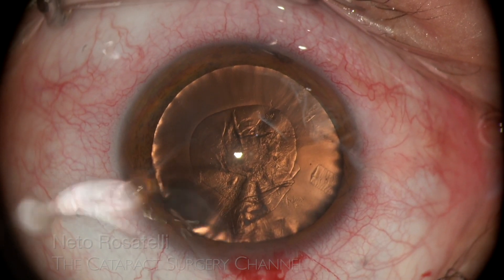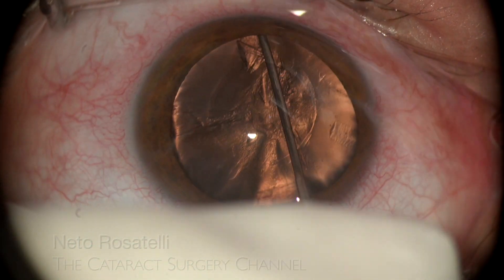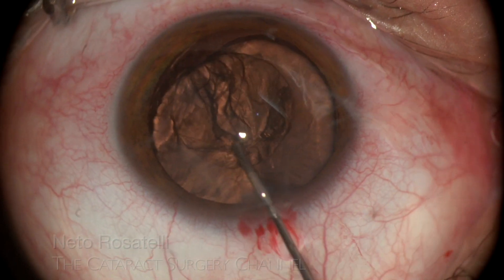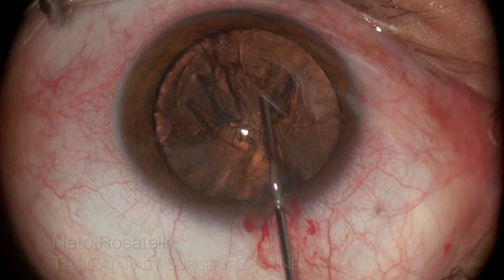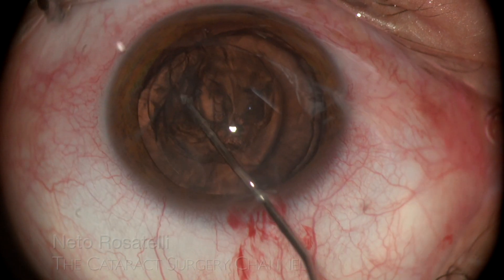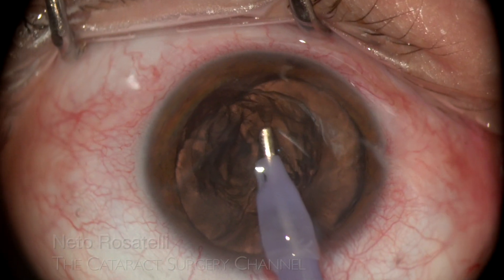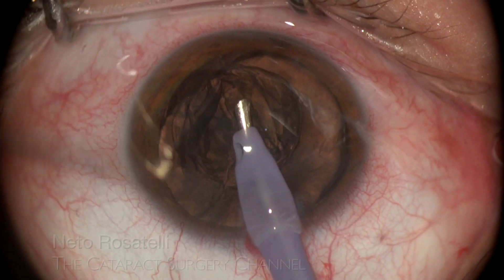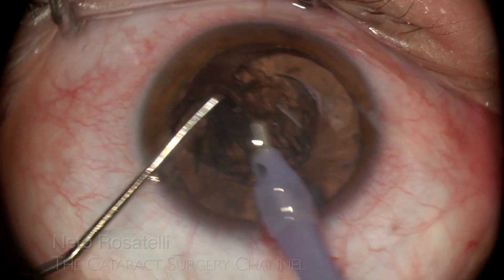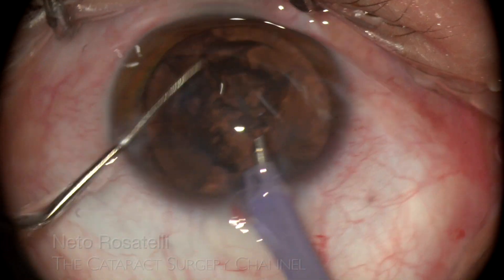The nucleus is very soft and, due to zonular compromise, effective hydrodissection and hydrodelineation are desirable, ensuring cortical release from the capsule and avoiding cortical aspiration issues. Here the nucleus wants to prolapse, but I keep pushing it back until I complete the hydrodissection and hydrodelineation. Adequate nucleus rotation is pursued for the same reason, and even with a little insistence, it is not achieved.